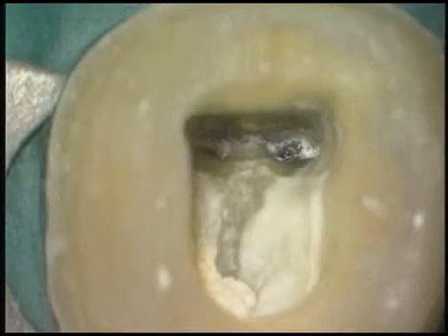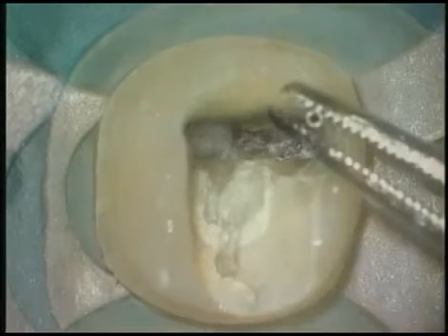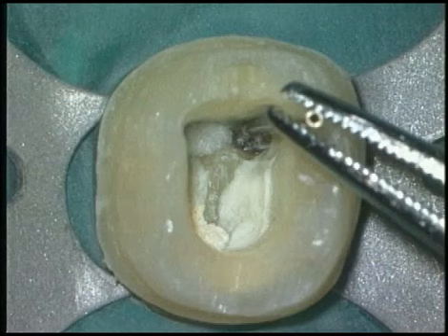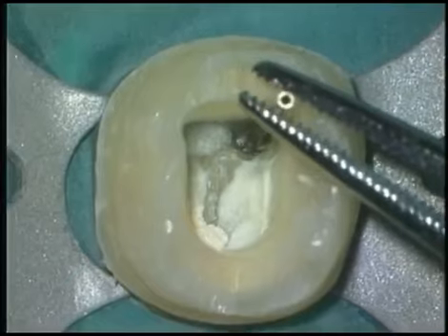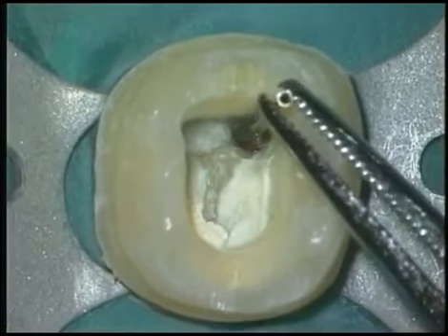Small hand files could be utilized in efforts to bypass the file. If hand files could create space lateral to the file, then the ultrasonic file adapter method could be employed. However, I will use a prototype IRS. Notice this pre-market version has no handle. The long part of the bevel is placed towards the outer wall, which will urge and encourage the broken instrument up into its lumen.